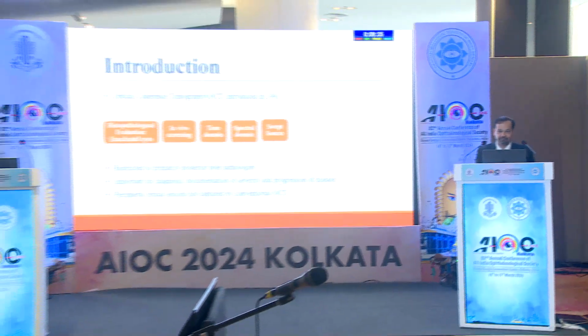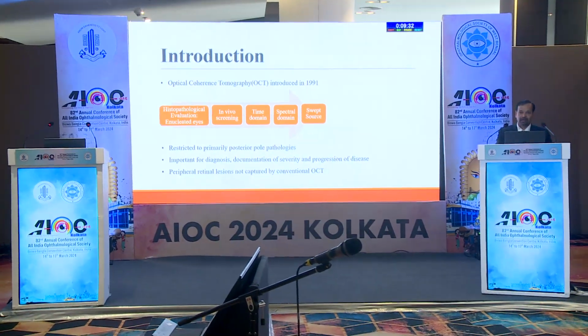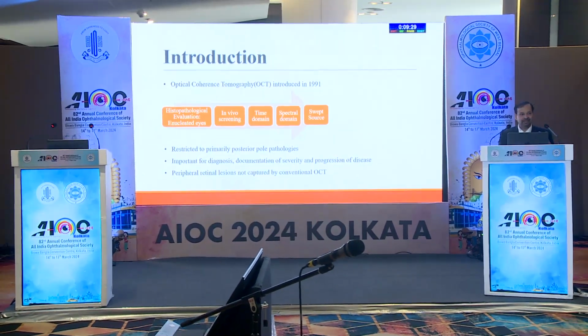At the outset, I would like to thank Saurabh for his wonderful talk. I'll be talking about a little less talked about topic called ultra-wide field OCT. Now, OCT has undergone its evolution. If you remember, we had time domain OCT sometime back in the 2000s, and we could see the retina only grossly, and with the onset of spectral domain, we could see the sublayers and the layers of the retina.